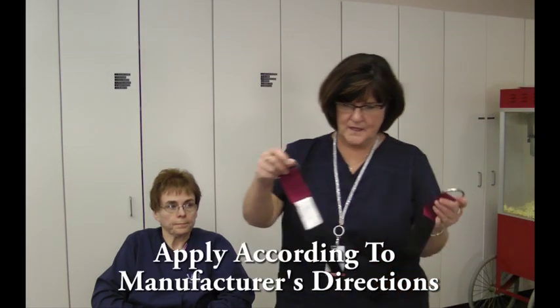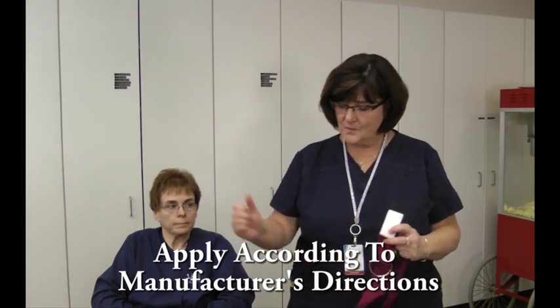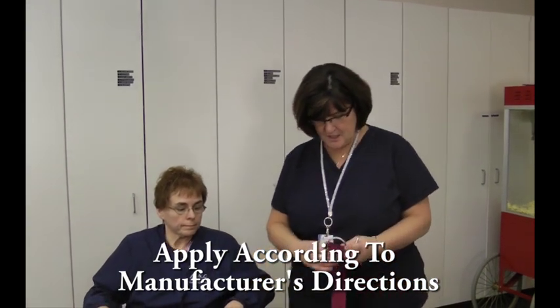The first one is a wrist restraint. This is going to go on the patient or the client, the resident's wrist, and then it's going to be down on a sturdy surface. We're going to use this arm of the chair right now.